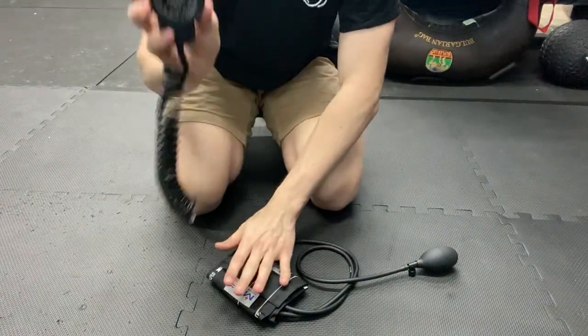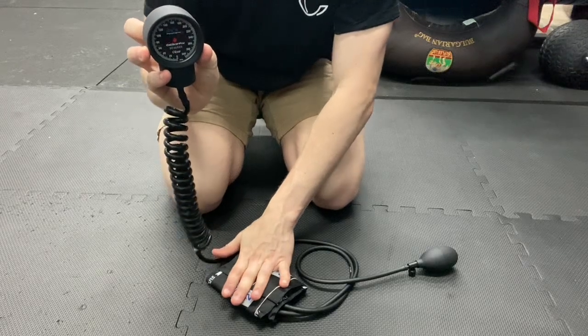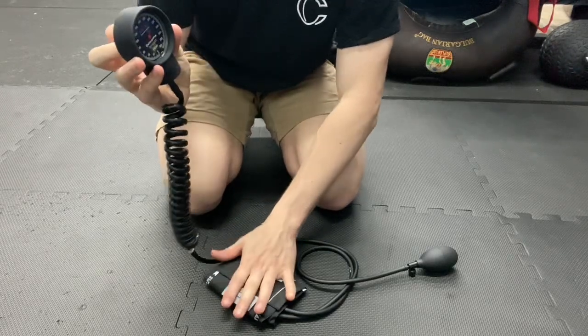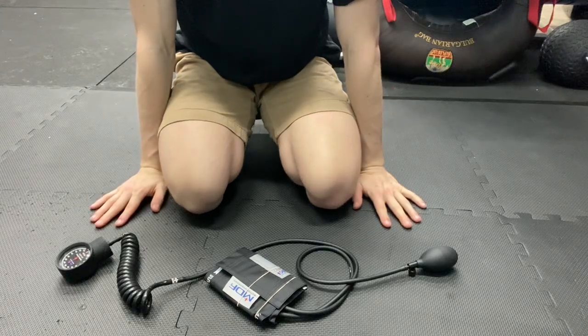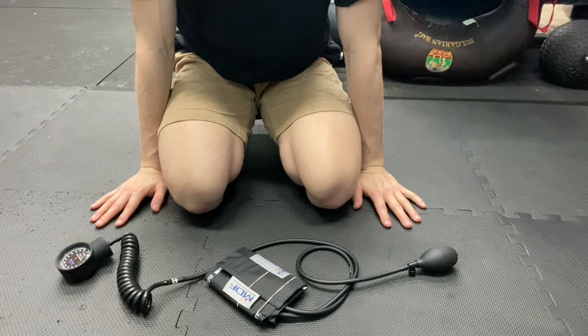Should pick up the gauge, put pressure into it. So that's how you set up your blood pressure cuff with your extension hose, and now it should be much, much easier to do your lower abdominal exercises.